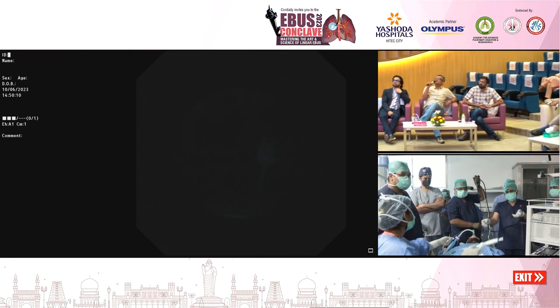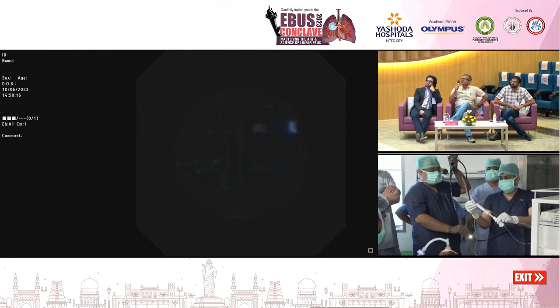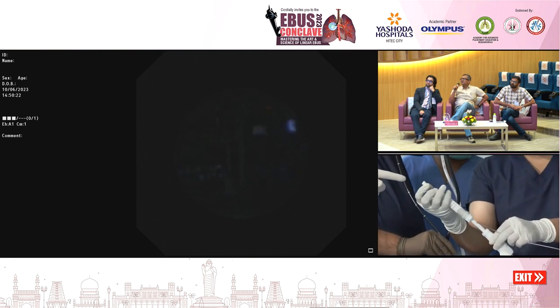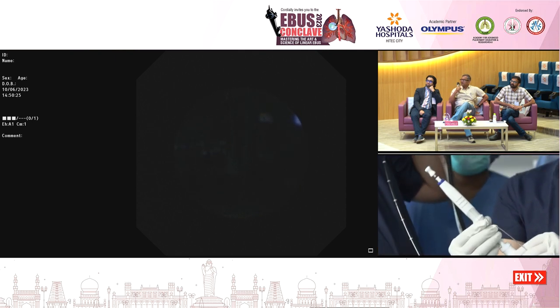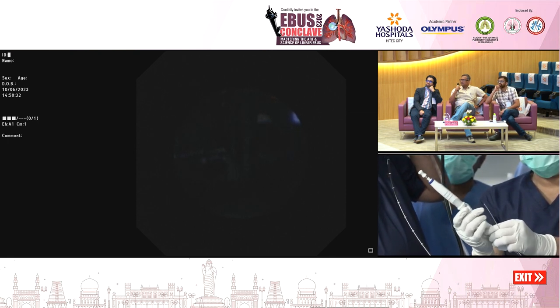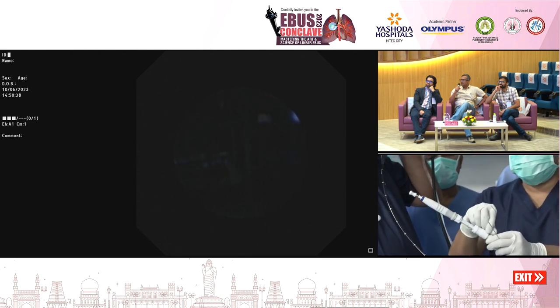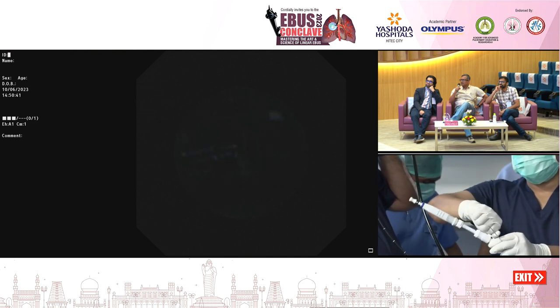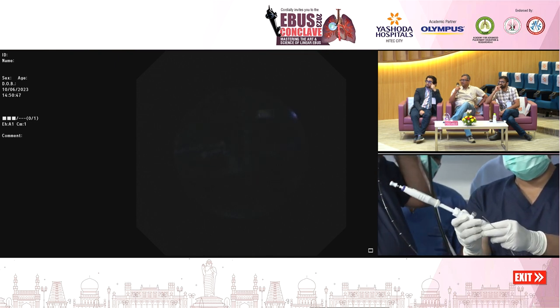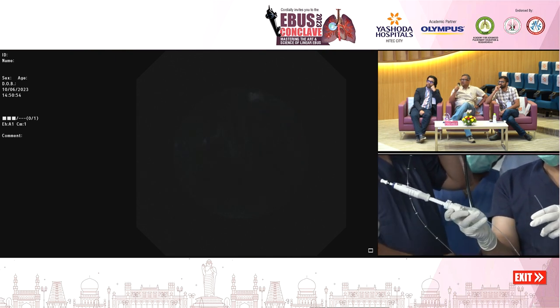Pratik, can you just tell us, when the needle is inserted, the parts of the needle very quickly, really brief but quick. Dr. Nitish is handling the needle, sir. So the part he's holding right now is the stylet. That is the needle length adjuster that sir is adjusting. That determines the depth of the needle. Then this is the sheath adjuster, the knob to adjust the length of the sheath. The role of the sheath is basically to protect the scope from the needle puncture. Protect the scope, sorry, not the sheath. And this is the fixing hub.